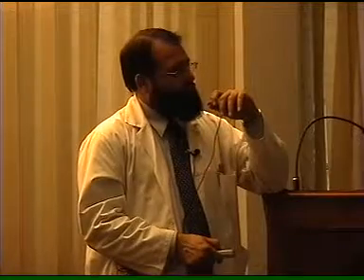Basically, the first initial deflection, if negative, is called the Q wave. It is called QRS because it is the ventricular depolarization signal. But it doesn't have to have all three components, Q, R and S. It may be only R and S, but it's still called QRS complex because as a norm, people started calling it that.